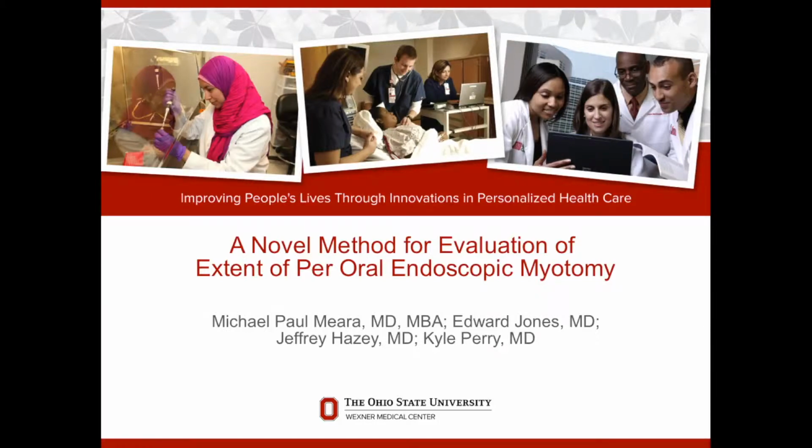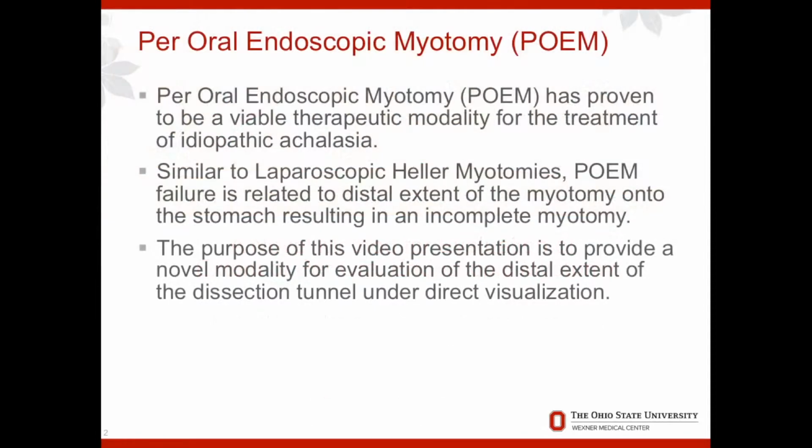A novel method for evaluation of the extent of per-oral endoscopic myotomy. Per-oral endoscopic myotomy has proven to be a viable therapeutic modality for the treatment of idiopathic achalasia.